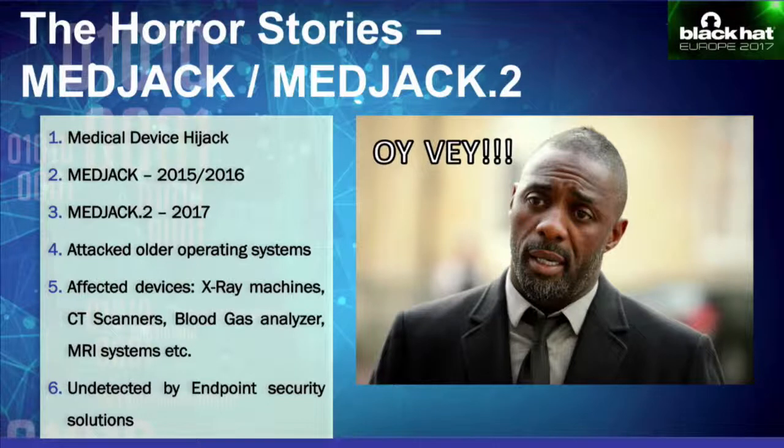And so it was stealthy, and it was able to compromise a lot of medical devices that had older operating systems. And older operating systems don't have any protection against malware. They don't have a security endpoint solution, so they didn't report the malicious activity either. So it went completely undetected, and once it compromised these medical devices, it started to use them as a pivot point to attack further machines on the network.